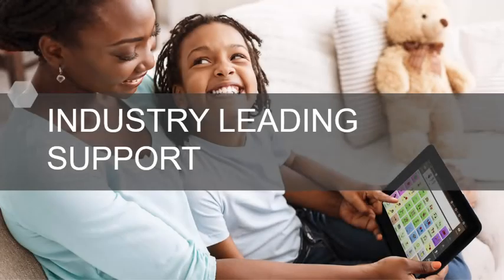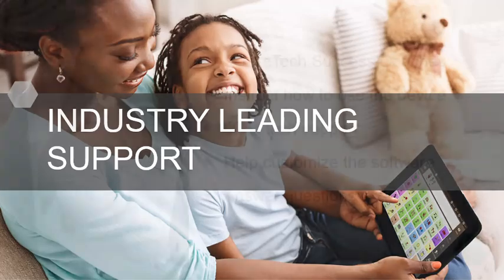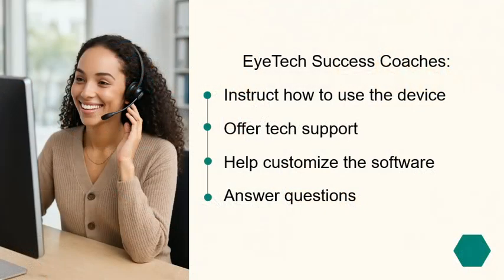EyeTech is proud of its reputation of providing unmatched customer support. A success coach will connect with you in a virtual meeting once you have received your device. We'll go over the basic use of the tablet, help customize the software, and answer any questions you may have. You can rest assured that you have EyeTech support for the life of the device. We want nothing more than for you and your loved one to succeed on this communication journey.